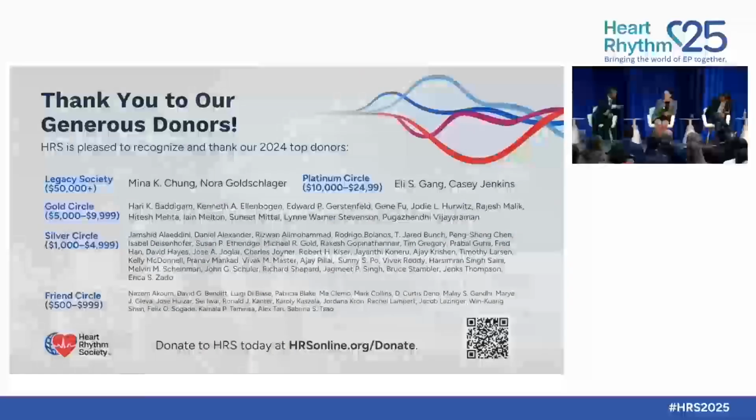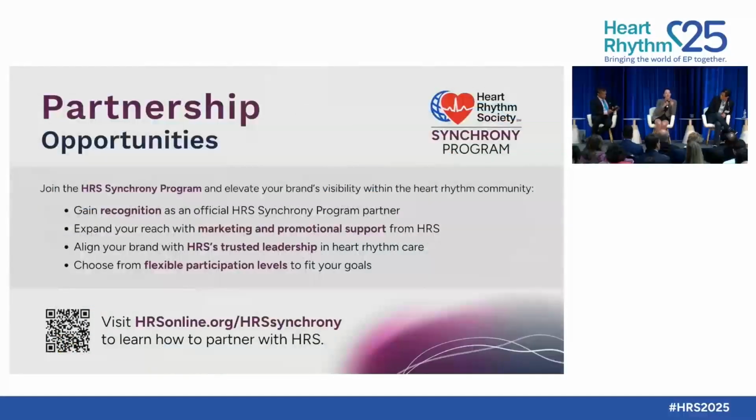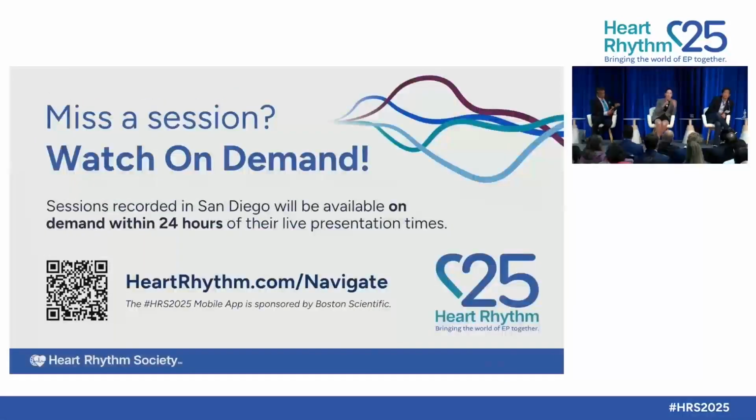No, I just wanted to add that if you historically look at all the AF mapping studies, dominant frequency mapping, ECG, et cetera, they always try to agree in the locations, pretty much what you said. There's always drivers or triggers, whatever you might want to call them, in the posterior wall and anterior, especially anterior to the left atrial appendage. But how do you target them?